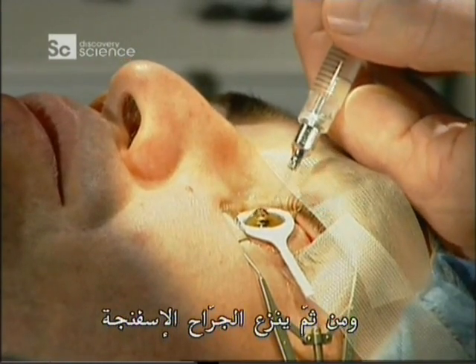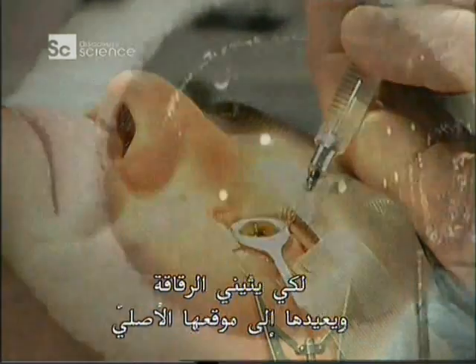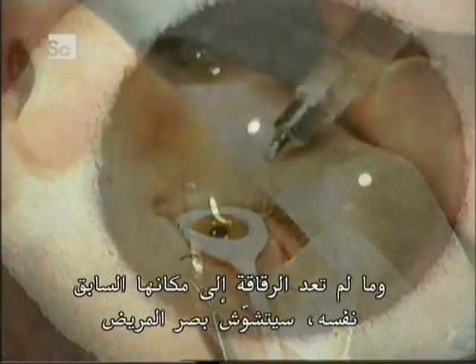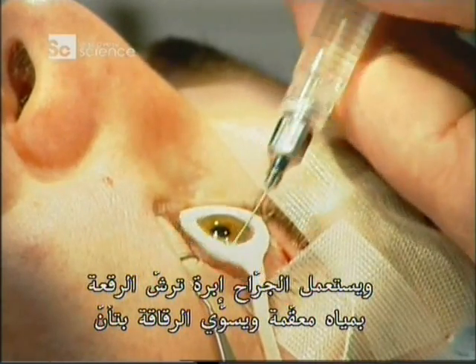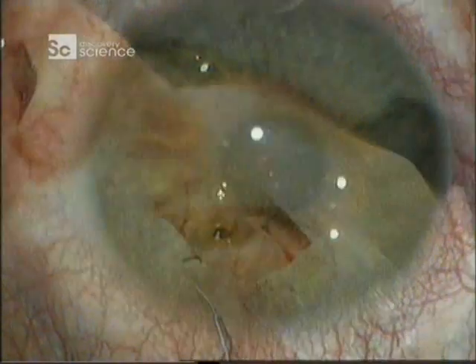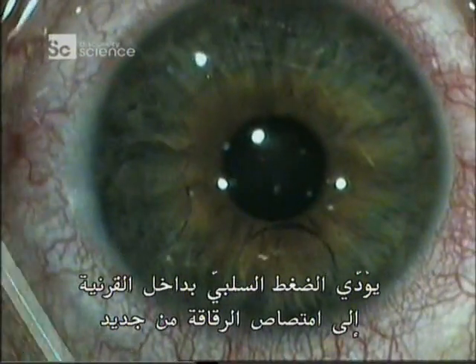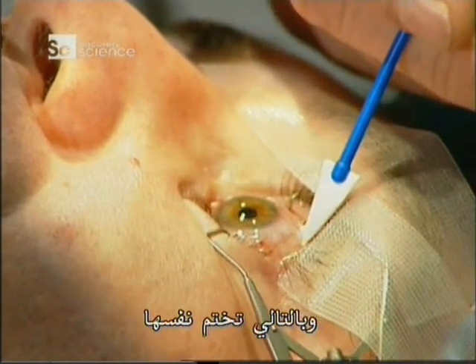The surgeon removes the sponge and then, using the ink marks he made earlier as a reference, folds the flap back to its original position. If the flap isn't precisely where it was before, the patient will have distorted vision. Using a syringe that flushes the area with sterile water, the surgeon carefully smooths the flap. Within 45 seconds, the negative pressure inside the cornea sucks the flap back on — the flap literally seals itself.